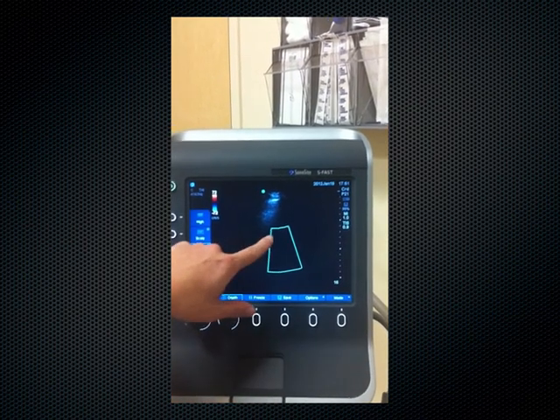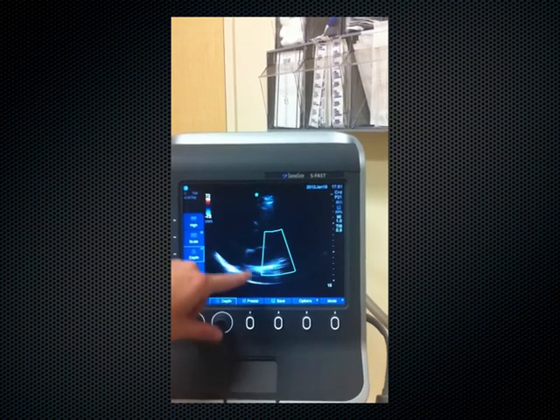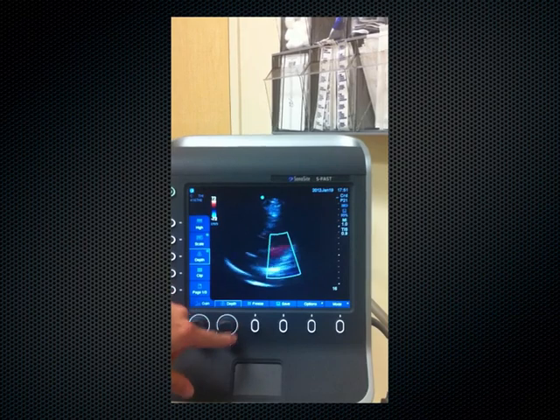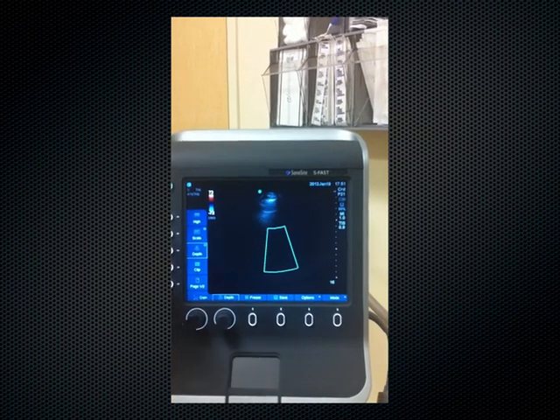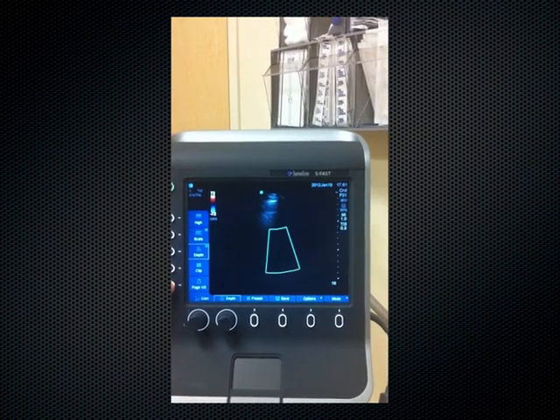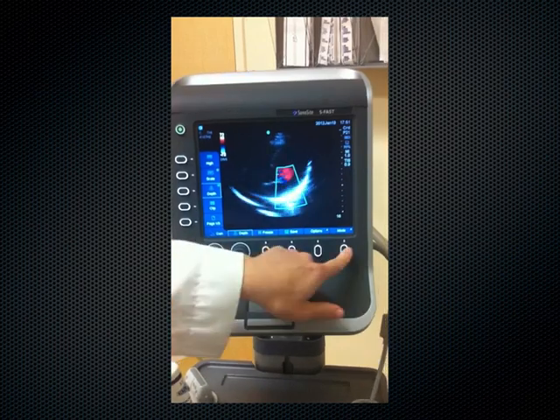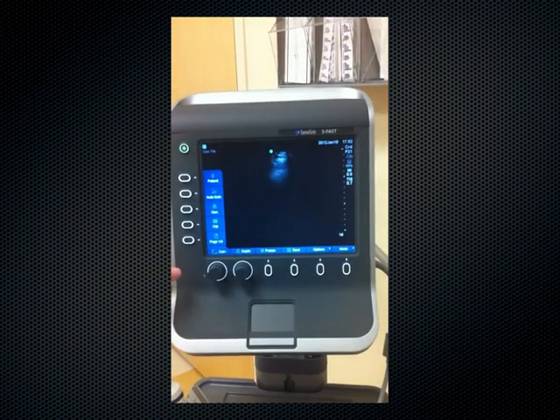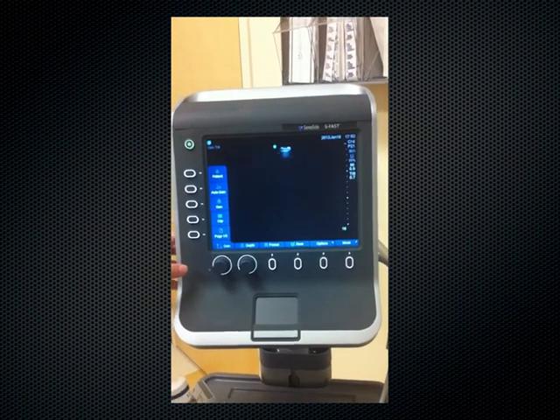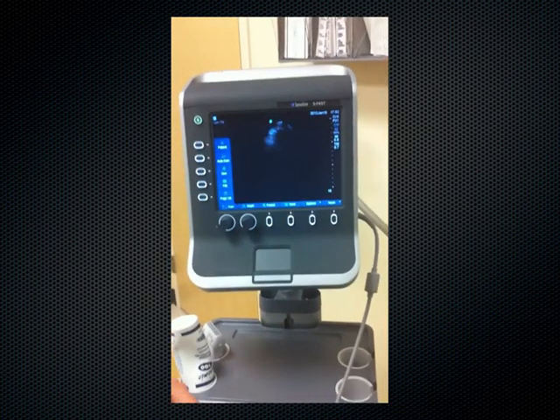What you see also here is the aortic outflow tract, and that's actually a 5-chamber view right here. The next thing I need to do is go back to calculations. So I'll go to mode 2D, and get a nice fifth chamber. Let's see. It's not as easy as it looks.